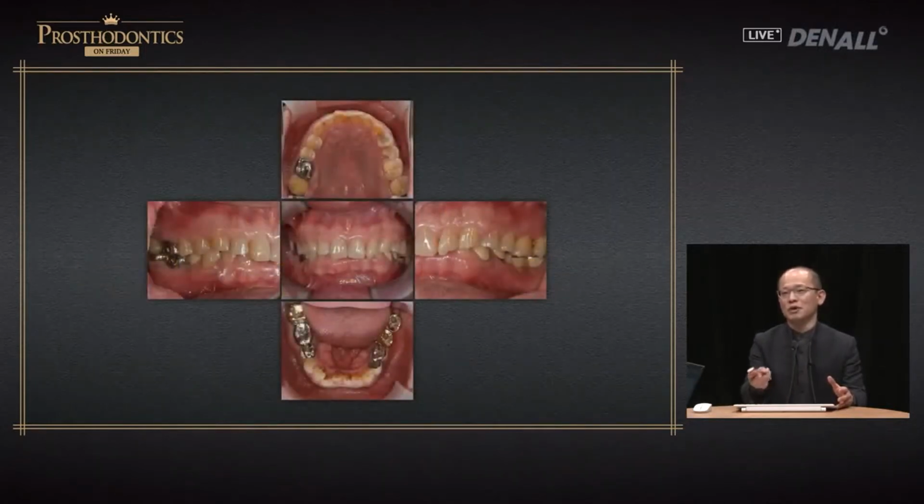So this is one case. It's an old case, and you can see the occlusal plane has waves, and there are fixtures used, but not much function, and you see a lot of fractures and wear. So this is a case where you need a full mouth rehabilitation.